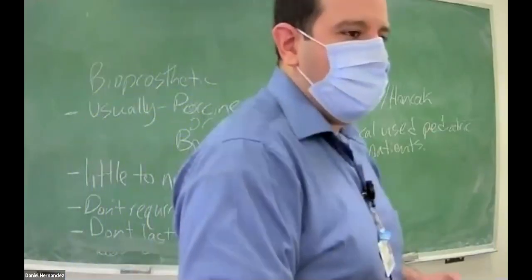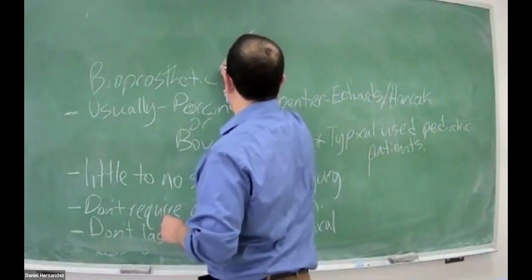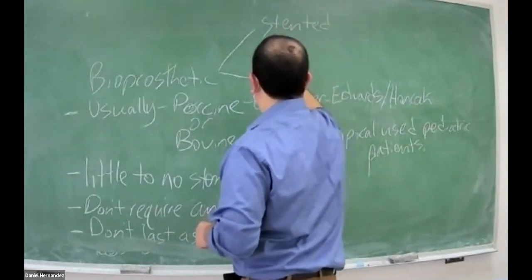Does stented and non-stented go under there too? Yep, that's under bioprosthetic valves. So bioprosthetic valves are broken up into stented and non-stented.